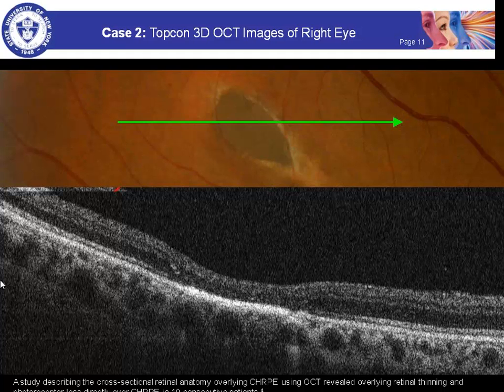OCT is helpful. If you look at Retina Revealed, one case back, there's one that was just released today or will be, we compare circumpapillary retinal nerve fiber layer measurements with OCT to GDX, and also to microperimetry, and also to another new concept called ganglion cell complex. That's in Retina Revealed, I think it's case number 34, where the comparisons are. I think that will be very helpful for you.